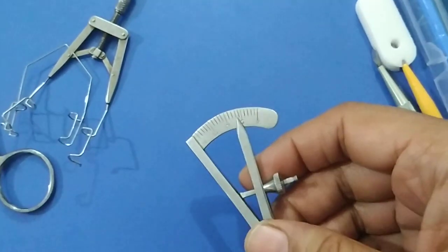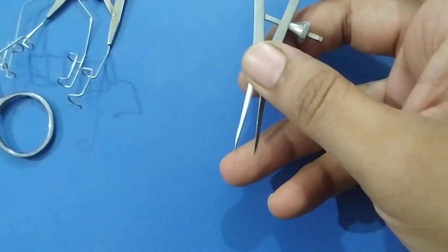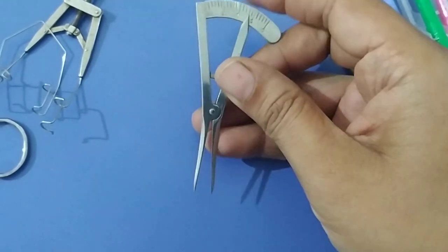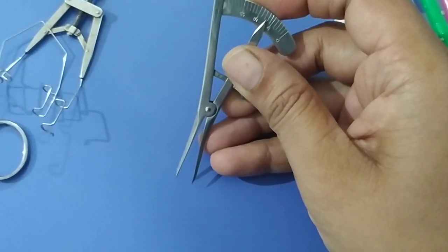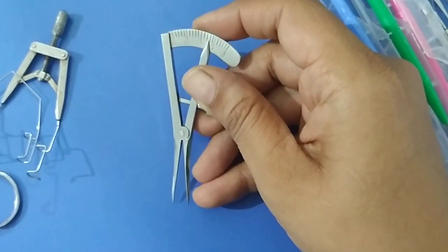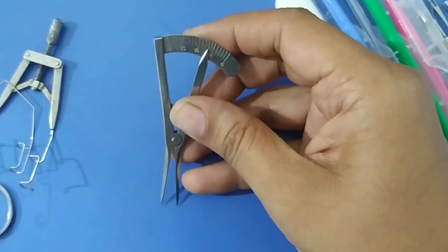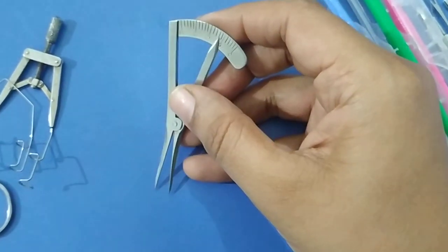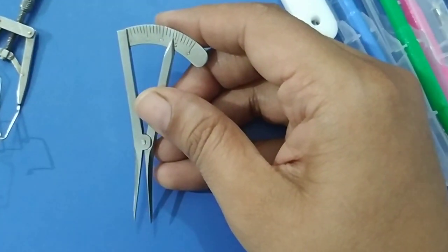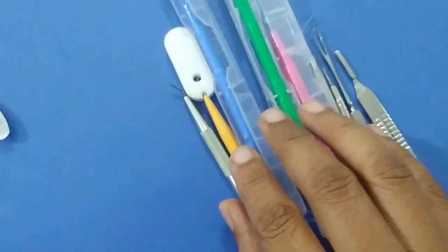This is our Castroviejo caliper. It has markings and a small scale. The Castroviejo caliper is used to measure the corneal diameter during congenital glaucoma, to measure the pupillary diameter, to measure the distance from the limbus during pars plana vitrectomy, and to measure the levator palpebrae superioris excursion during ptosis surgery.